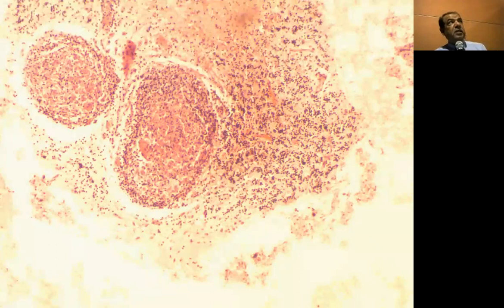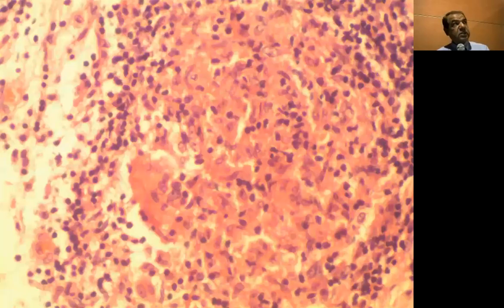There are lymphocytes, and these are histiocytes with many giant cells. The histiocytes usually form a whirling pattern. You can tell this is cerebellar tissue, and there is a granuloma here and a granuloma here. Now we are in the cerebellar tissue, and all these are granulomas, multiple granulomas, many of them. Some of them are around blood vessels.